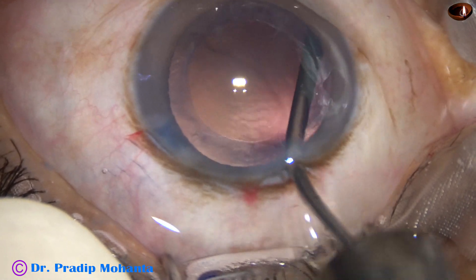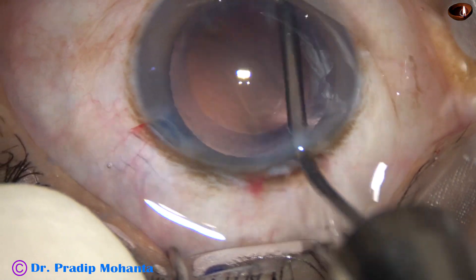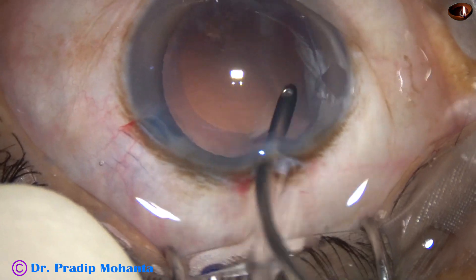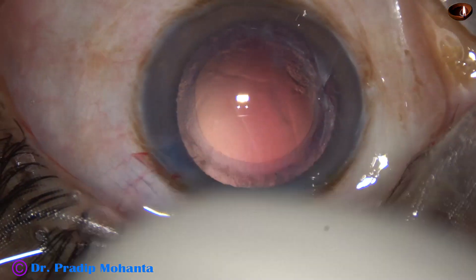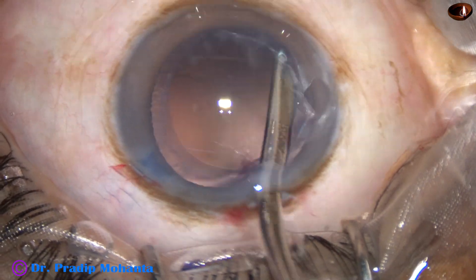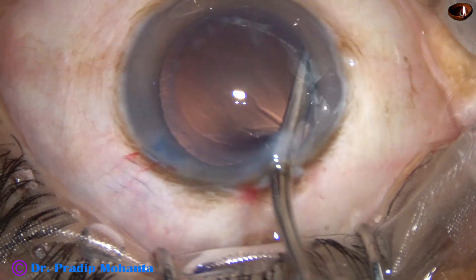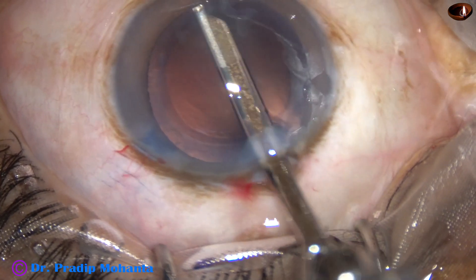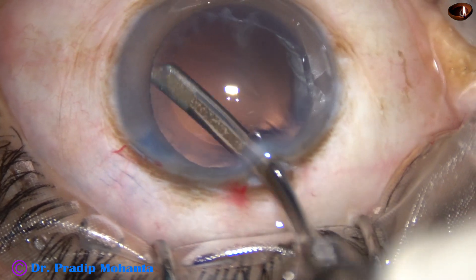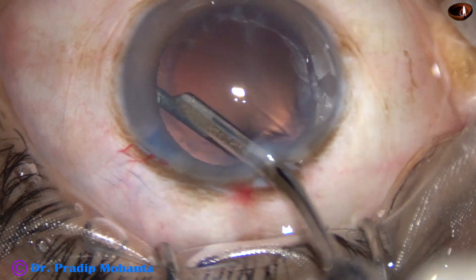There are some cells sticking to the posterior capsule near 9 o'clock. The cells are dislodged by irrigation just by the irrigating probe. I am going to use the Simcoe cannula again to remove these lens fibers. There is some more polishing of the undersurface of the anterior capsular rim.